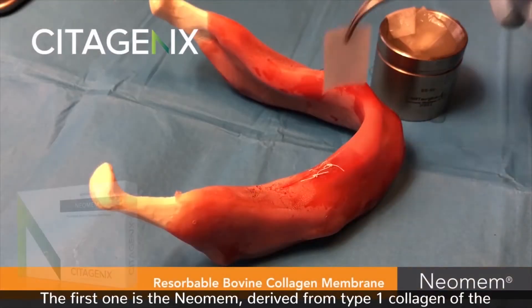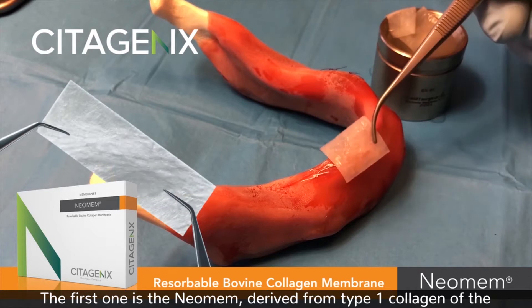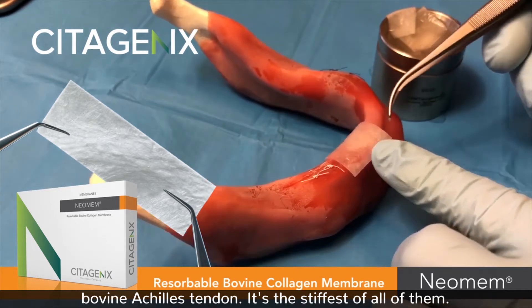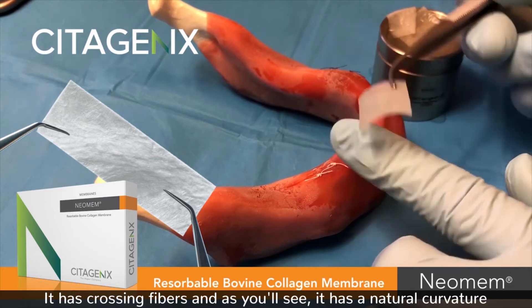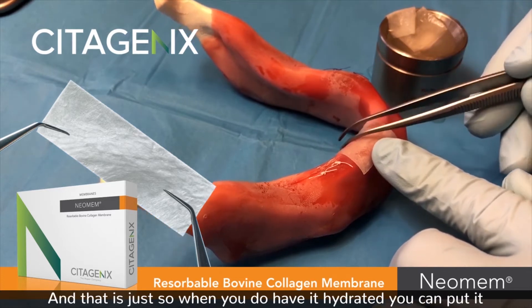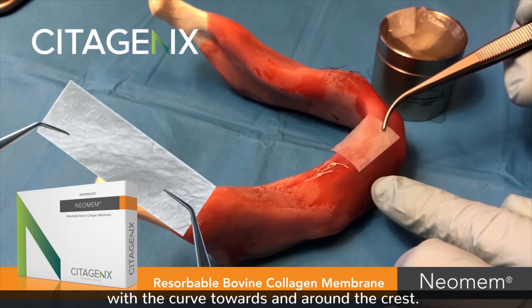The first one is the Neomem, derived from type 1 collagen of the bovine Achilles tendon. It's the stiffest of all of them. It has crossing fibers and, as you'll see, it has a natural curvature — that is on purpose from the manufacturer — so when you have it hydrated you can put it with the curve towards and around the crest.